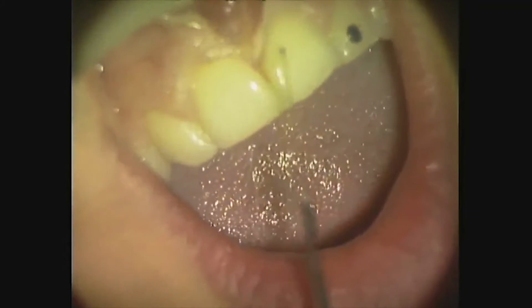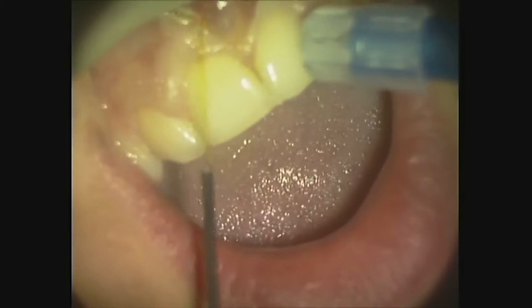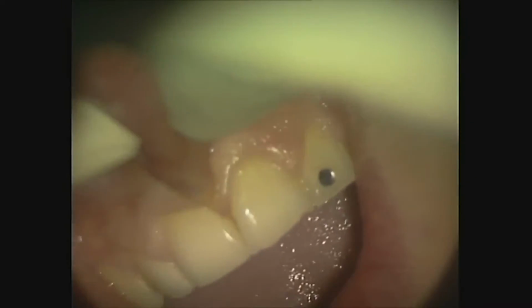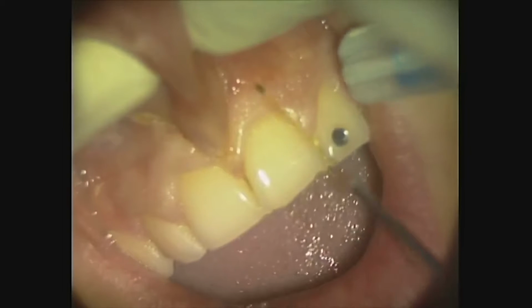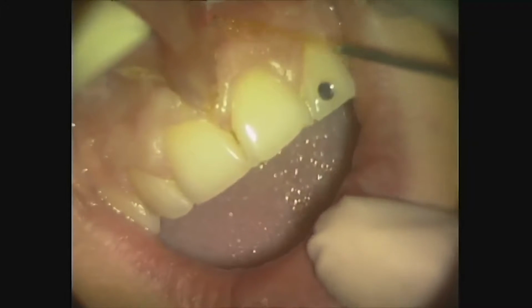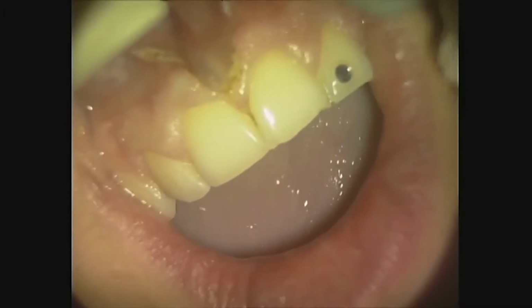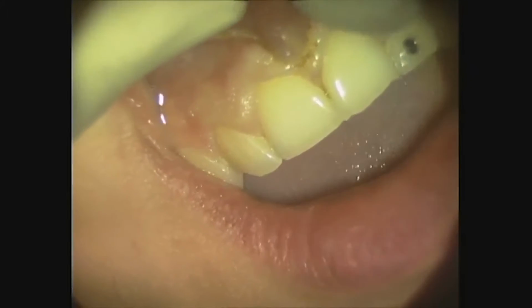Look, my assistant uses a gauze because we are in contact and some debris can cover the tip. So look, we are cutting and cutting with different layers. Use a gauze, thanks. And from the other side, sorry, I'm working with my microscope, so I change the position. It's better to be perpendicular to the tissue. 1, 2, 3, 4, 5, 6, 7, 8, 9, 10. Okay, great.